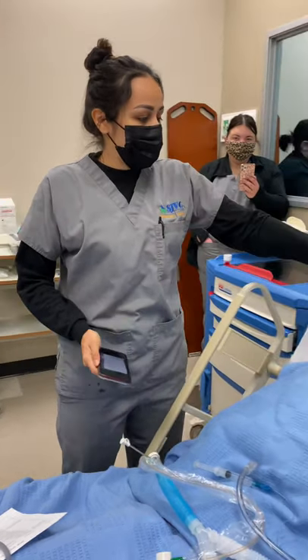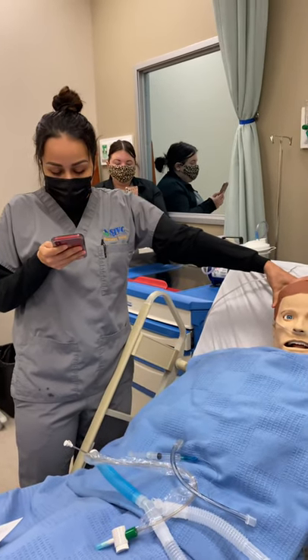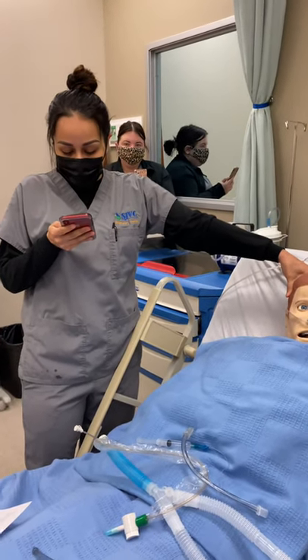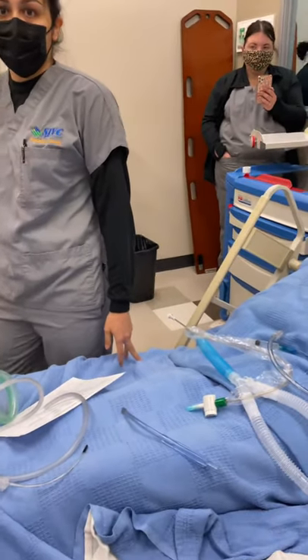Go ahead and say hello. We're hearing how he sounds and everything like that. And then at this point, you'll go ahead and do the bilateral breath tones and check for auscultation.